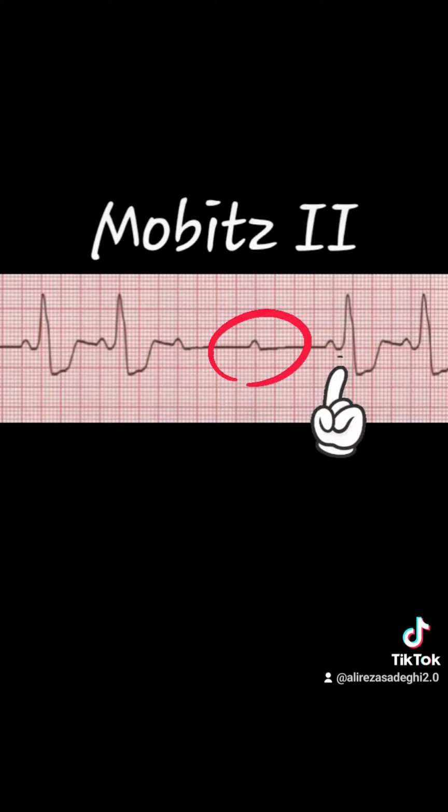at the PR interval after and the PR interval before. And as you can see, again, they're the same exact measurement. And for this reason, again, this is going to be a Mobitz 2.